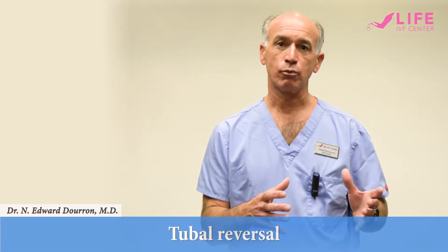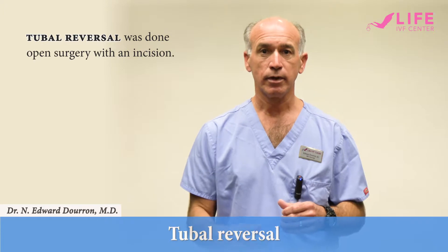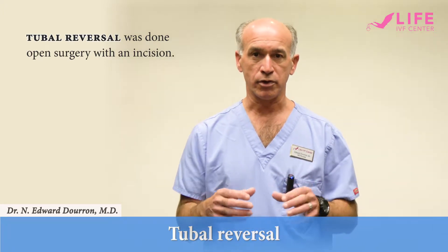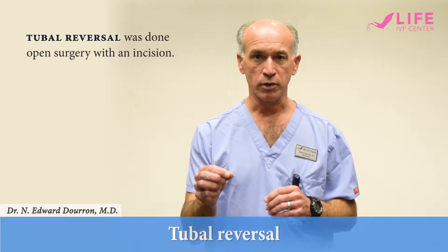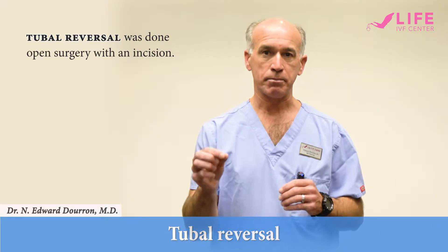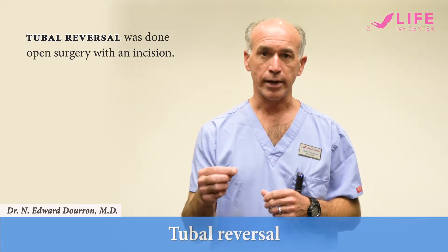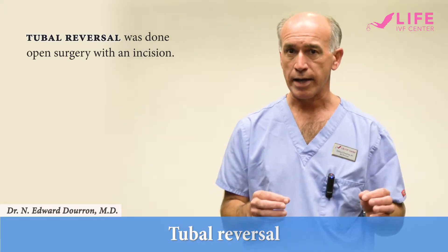In the past, what we've done is open surgery with an incision similar to a c-section, where we are placing a surgical microscope over the incision. We're able to do microsurgery to remove any burned or scarred tissue, any metal clips that may have been used to block the fallopian tubes, and reconnect the fallopian tubes in two layers using very fine suture material that's half the diameter of human hair.